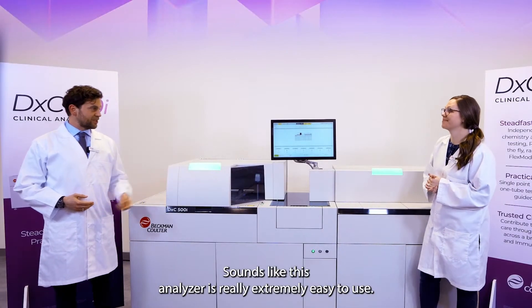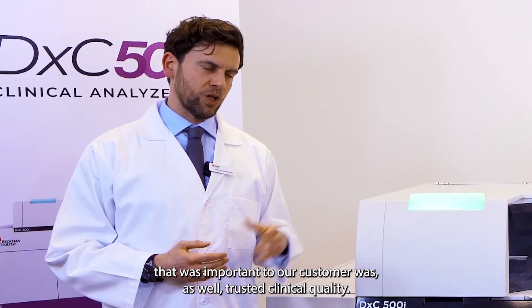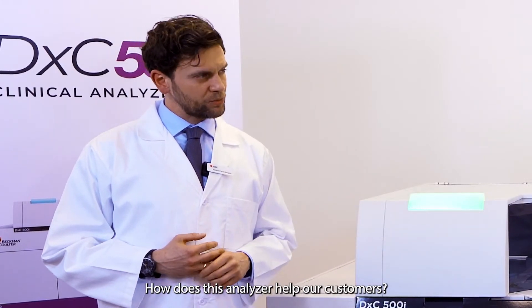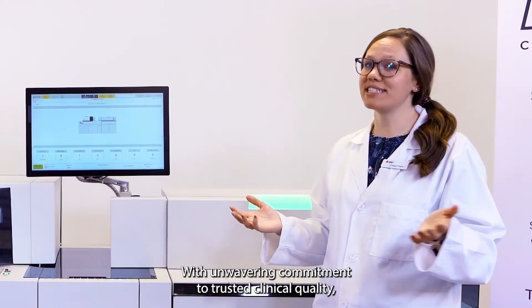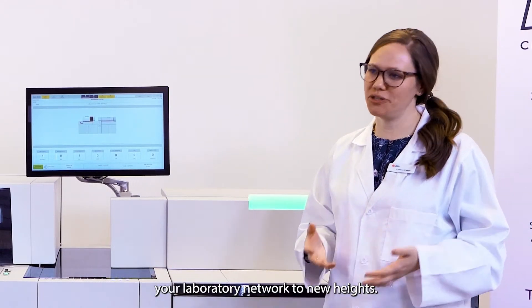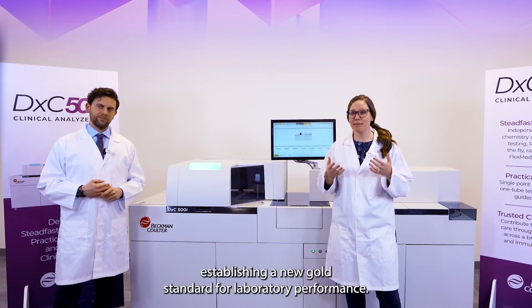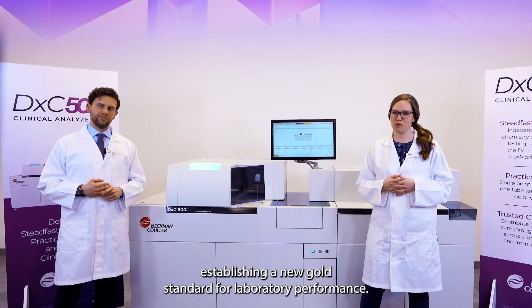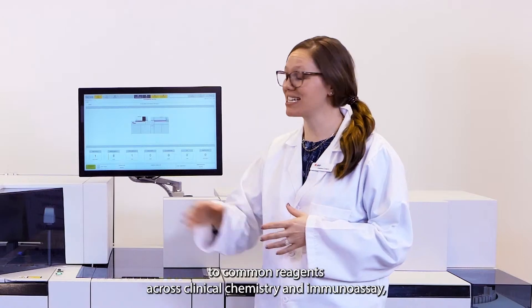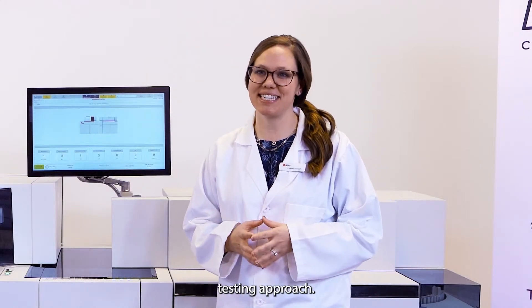Sounds like this analyzer is really extremely easy to use. Something else that was important to our customers was trusted clinical quality. What does this mean for the DXC 500i? With an unwavering commitment to trusted clinical quality, the DXC 500i is poised to elevate your laboratory network to new heights. Our Six Sigma chemistry assays ensure unmatched quality, establishing a new gold standard for laboratory performance. What truly distinguishes us is our dedication to common reagents across clinical chemistry and immunoassay, fostering a unified and standardized testing approach.